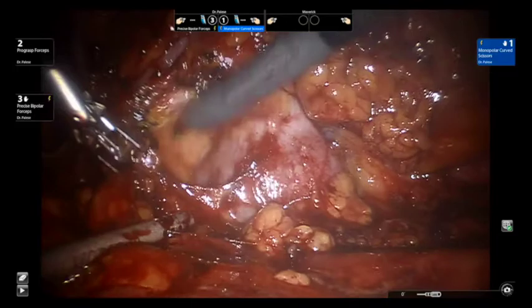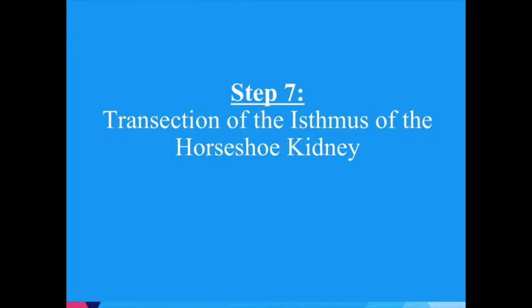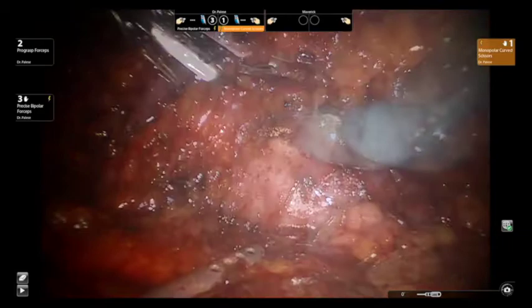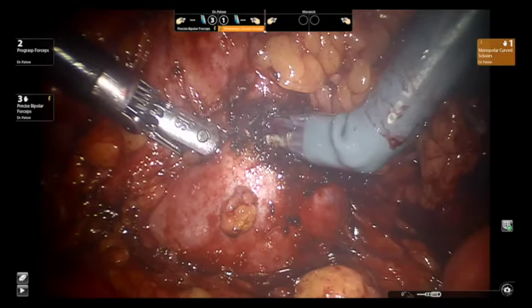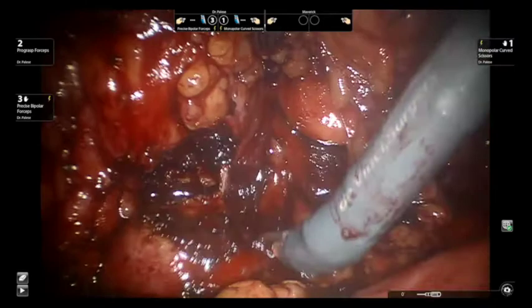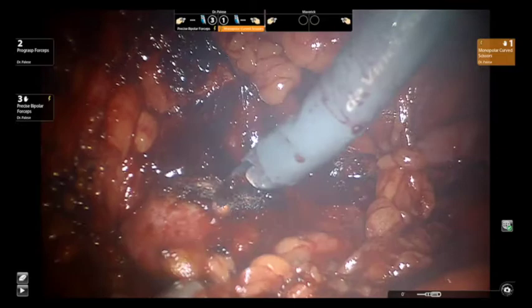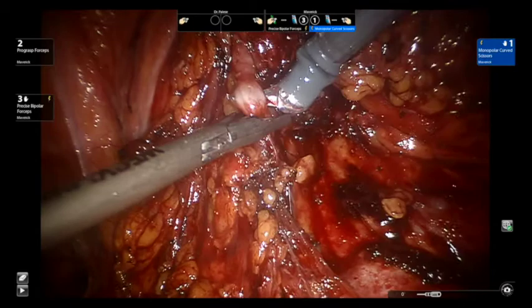The isthmus is then adequately exposed to facilitate ligation. Next, the isthmus is transected in a hemostatic fashion using the monopolar electrocautery. Attention is then turned to the ureter, which is identified and divided between clips.